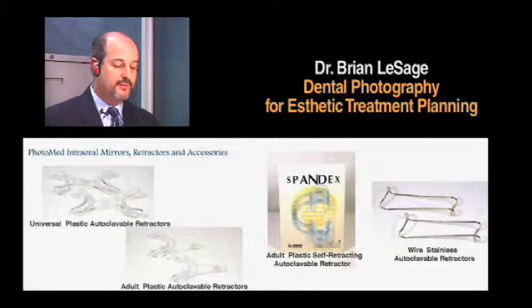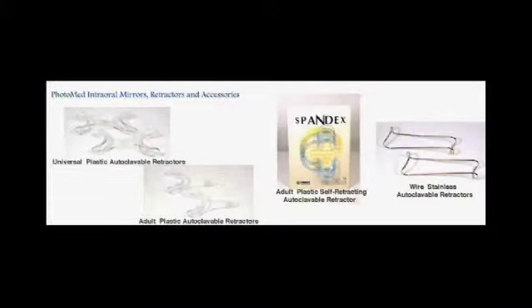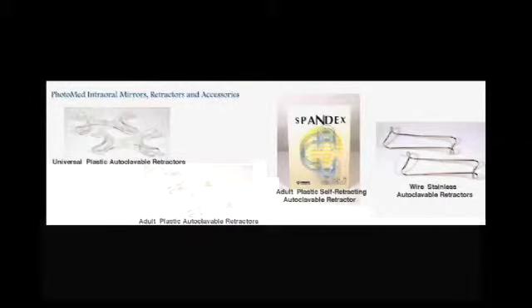Then certainly you need lip retractors. These are the ones that I prefer. Certainly these are okay. I can tell you Frank swears by these, so try different ones. These are just a little bit big sometimes, but they do a wonderful job retracting. These are probably not quite as patient-friendly. These are just a little bit more patient-friendly. Put these in your own mouth sometimes, and you'll find they're not really that comfortable.